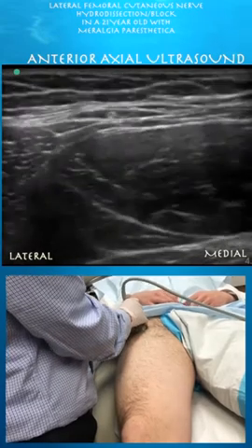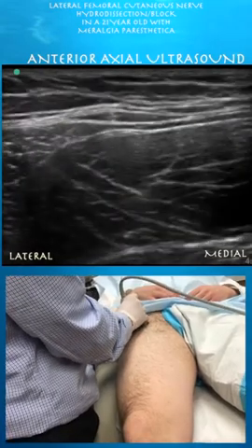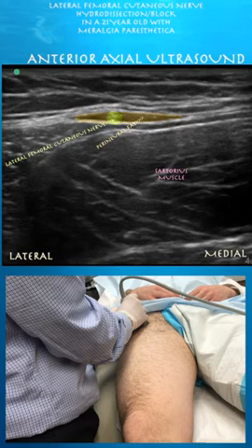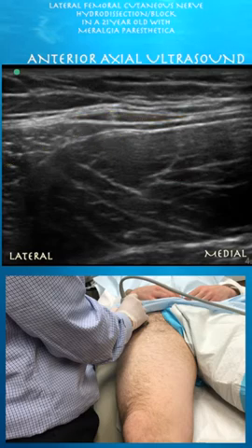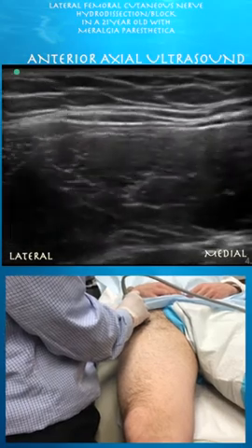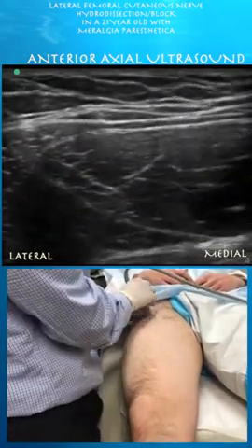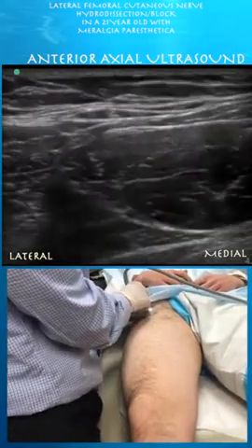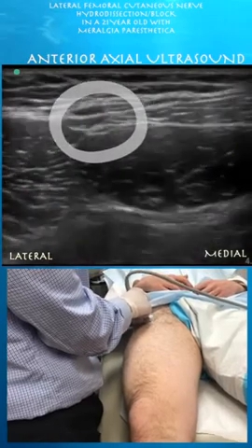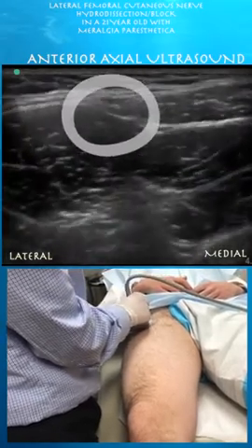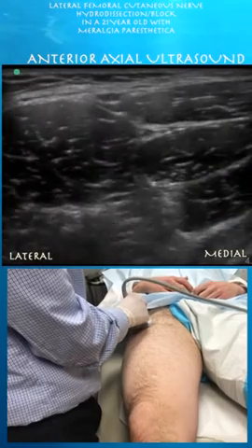Here's quite a sizable lateral femoral cutaneous nerve. You can see all that perineural fat surrounding it, as well as the enlarged nerve itself, consistent with this patient's symptoms. If we just follow that nerve down — here we're looking at the lateral femoral cutaneous nerve — we can follow it distally, just highlighting the nerve as you go distally.